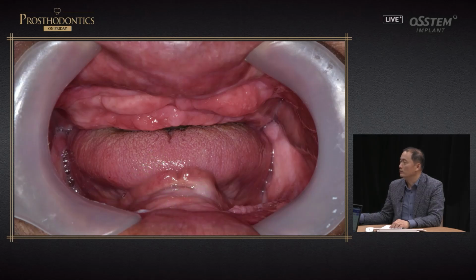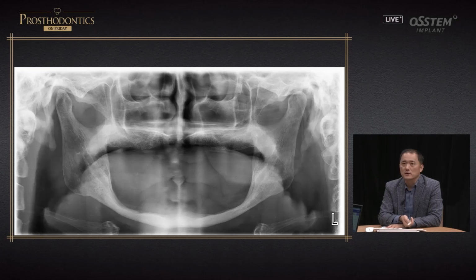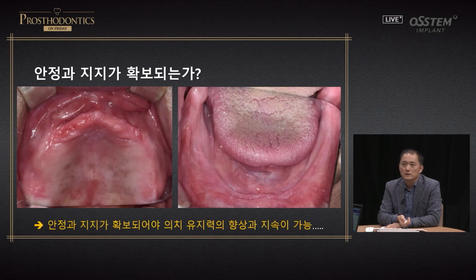So let's look at a case where there's a lot of ridge resorption on the mandibular side. There's even convexity, so there's severe ridge resorption, and the radiograph shows that the ridge is really fragile. And actually for this type of patient, securing retention and support or stability is not easy.